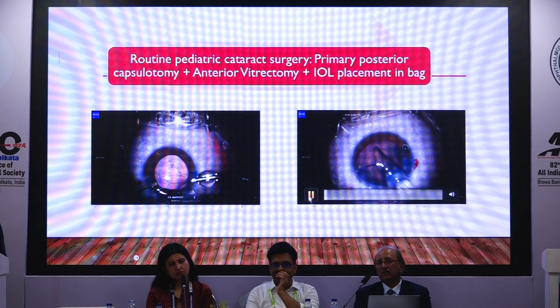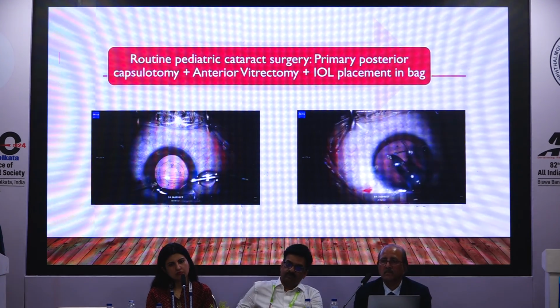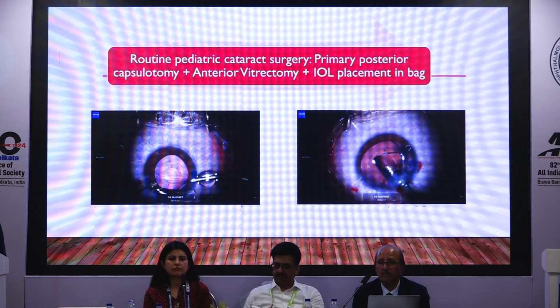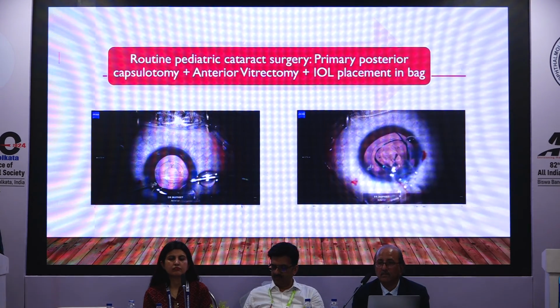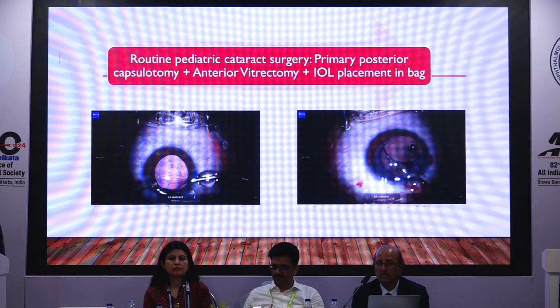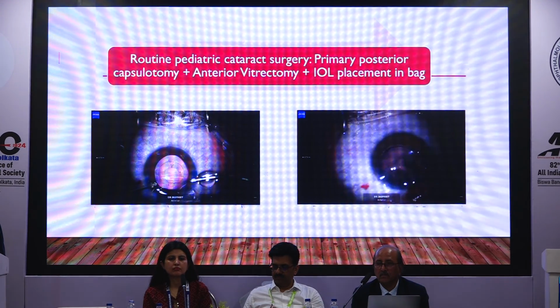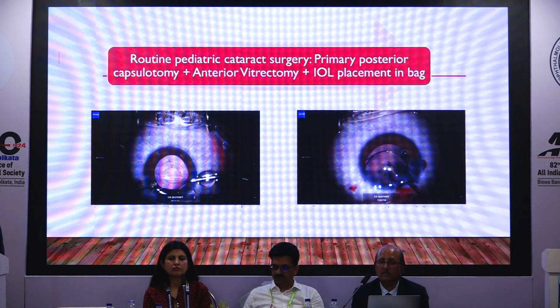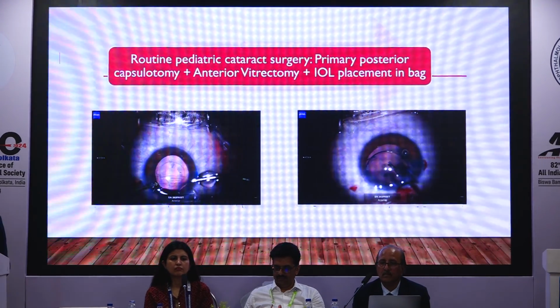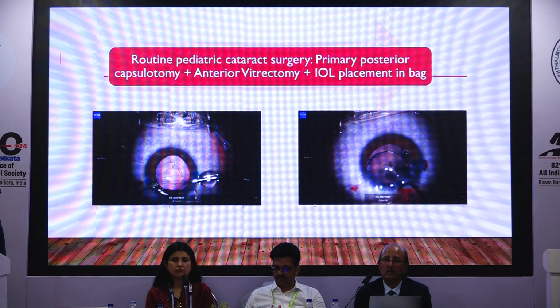So this is what is done. It's a foldable IOL, a 3-piece hydrophobic acrylic IOL, and you have to be a little bit careful so that the haptics just don't go down into the posterior capsular opening you've created. So gradually you dial it inside the capsular bag, and the ideal situation would be when you have an anterior capsule covering about 0.5 millimeters of the IOL. That will lead to much less chances of posterior capsule or visual axis opacification. That's the conventional way of implanting the IOL, and that's the bag where it should be implanted.